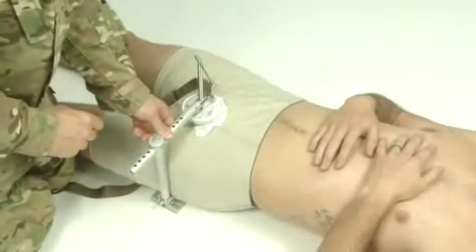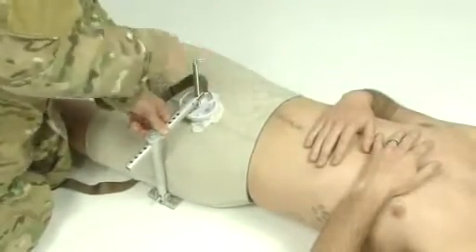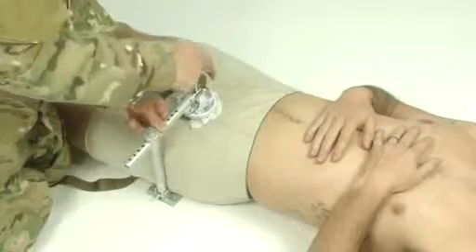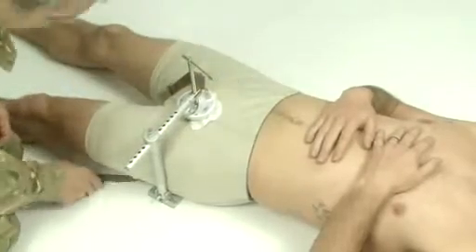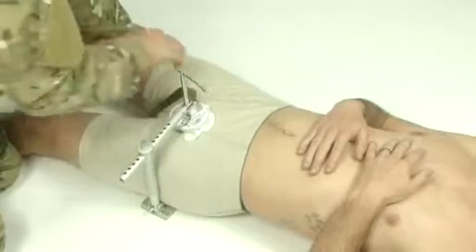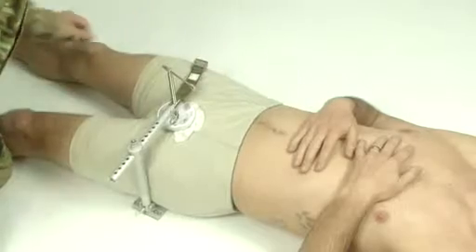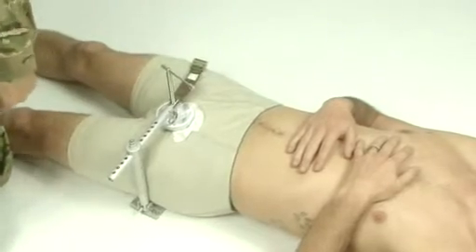Apply pressure to the dressing by turning the T-handle clockwise. Apply pressure until the bleeding stops. Attach the securing strap. Write the time of application on the label.